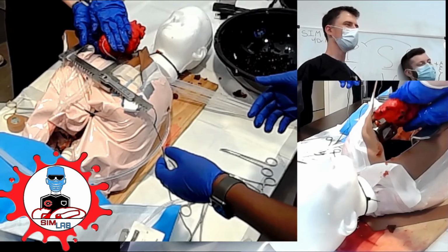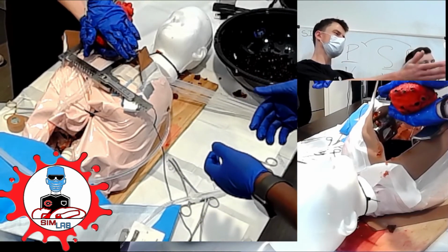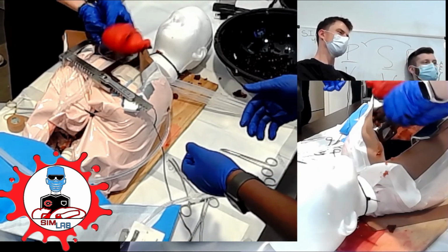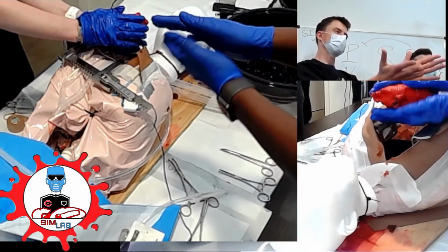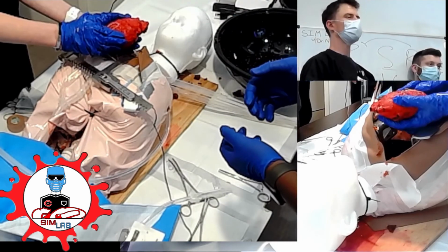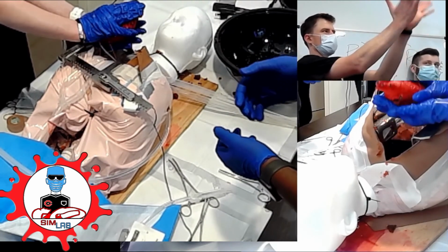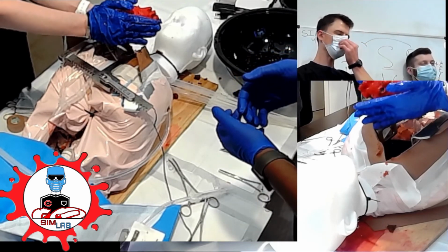Okay. So flat hands. Use the base of your palms, kind of the apex, and so you're going to go apex to base. Other way. There you go. Like that. So you have to be on the left side. I mean, you have the heart in your hand, so. Here we go. Yeah, so kind of like this. So don't put your fingers through the atrium.